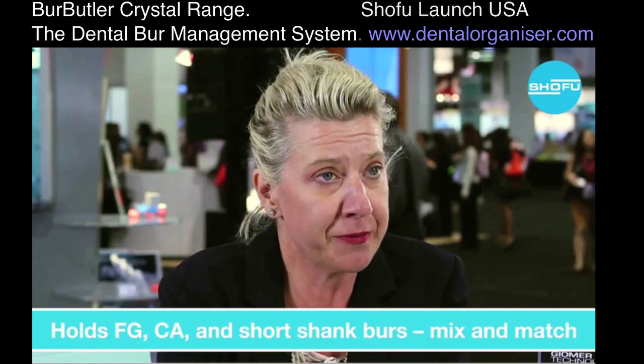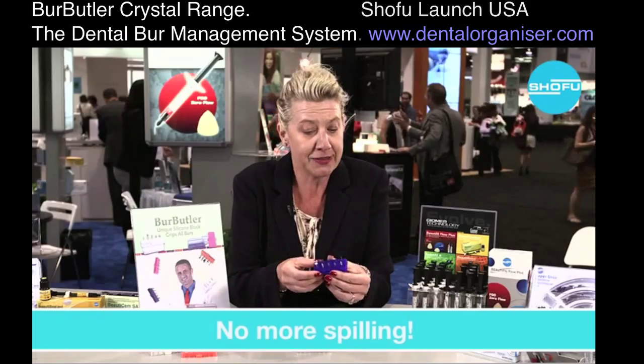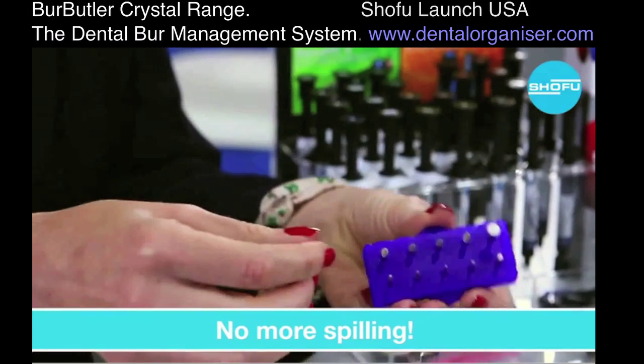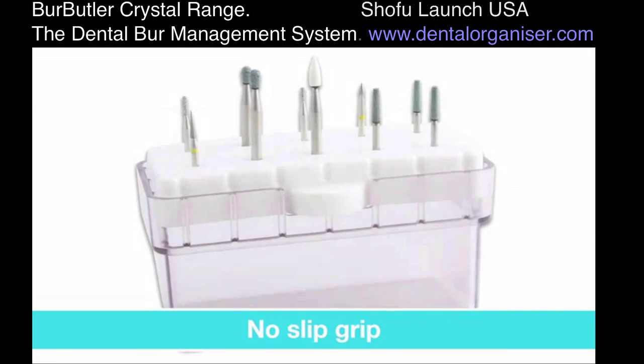You can put latch grip and friction grip side by side in this burr caddy, and the nice thing is you can turn it upside down and nothing falls out. In fact, if you got all the colors you could juggle them — if you could juggle.